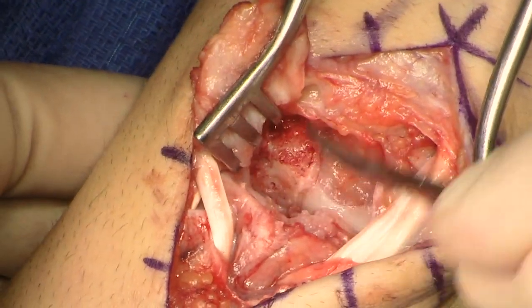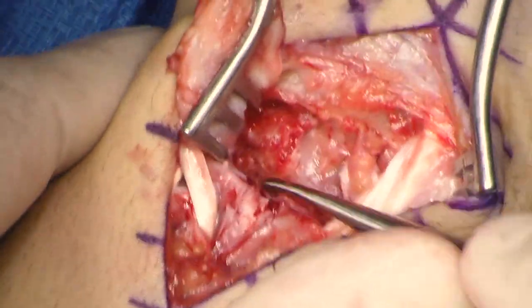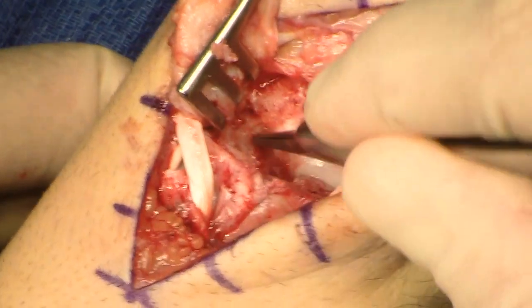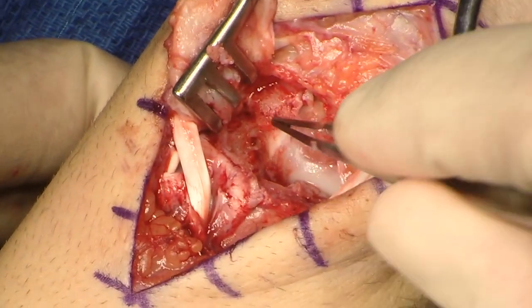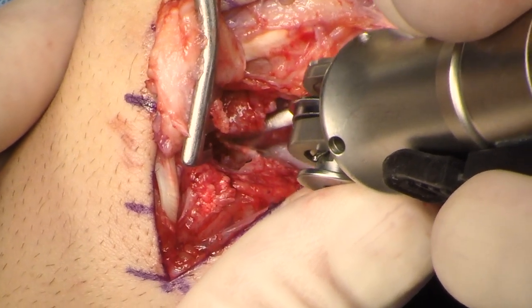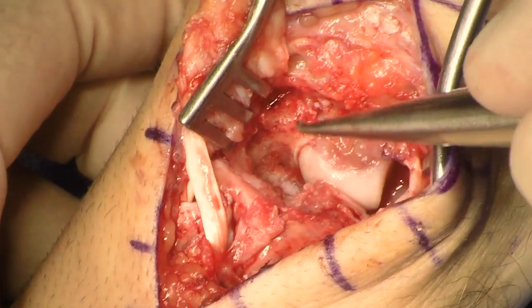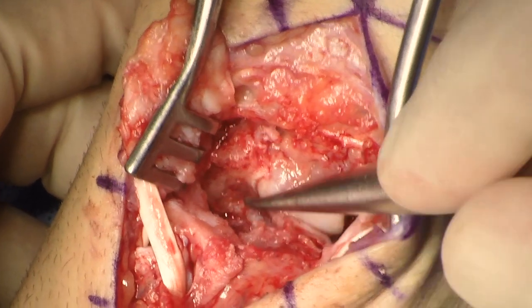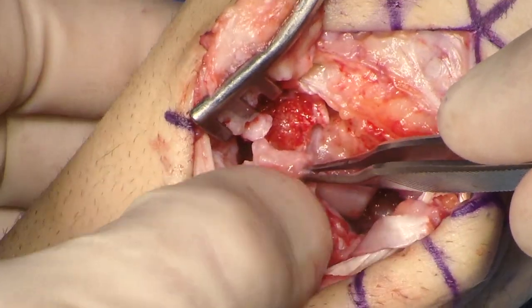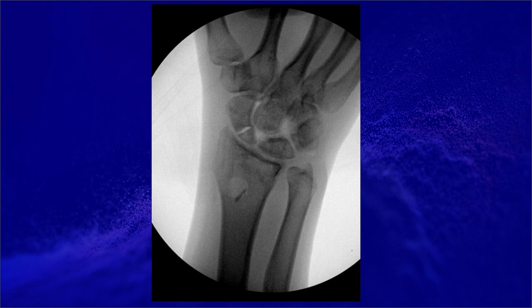The scaphoid was then inspected. More debridement was required to get down to bleeding cancellous bone. The scaphoid was again inspected — there was bleeding cancellous bone. The cortex needed to be trimmed to get as flat a surface as possible. A freer was placed between the scaphoid and the capitate to protect the capitate. A flat recipient site can be appreciated. The graft was then inserted into the defect. Intraoperative fluoroscopy demonstrated an excellent size match and cortical opposition.